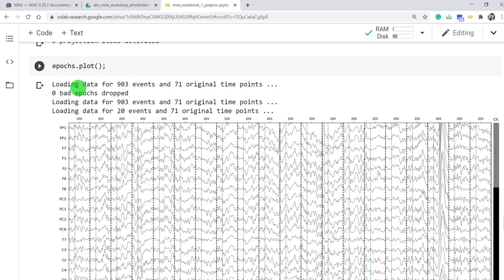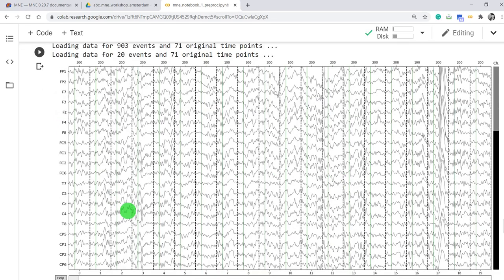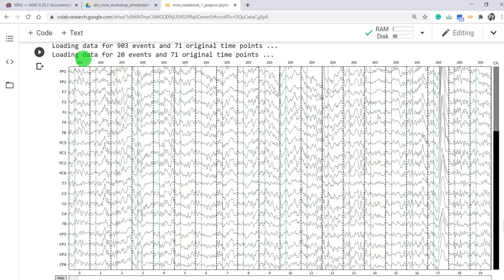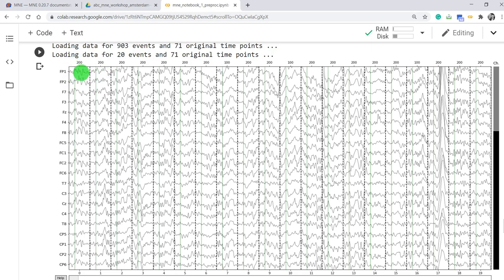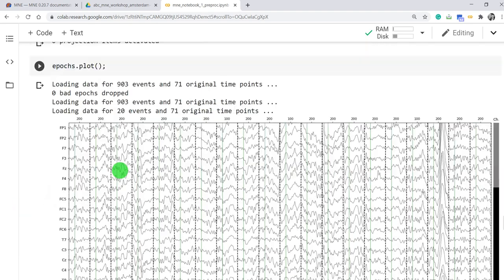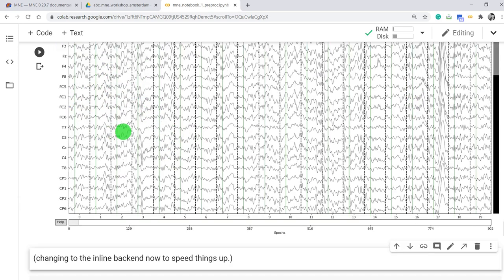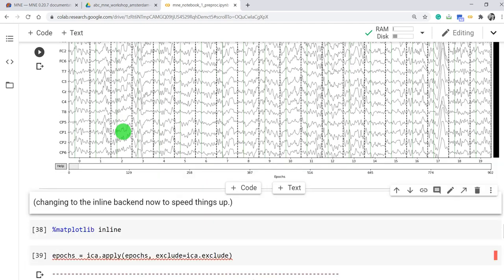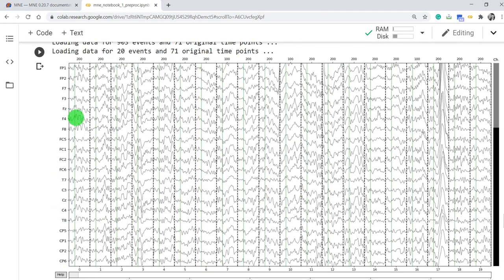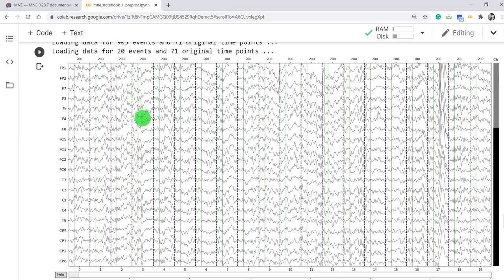Here we go. Channel information, and we have event IDs, 200, 200, 200, and 100. Non-target, target, non-target, target. And this dashed line separates two epochs. So epochs here is the time segment of one trial, one observation of EEG. First trial, second, third, fourth. So continuous data that has been segmented from continuous. We can observe here some of the noise patterns we have discussed before. Look, this looks like an eye blink artifact in the data.